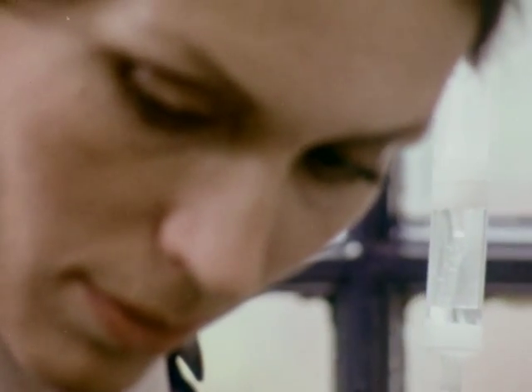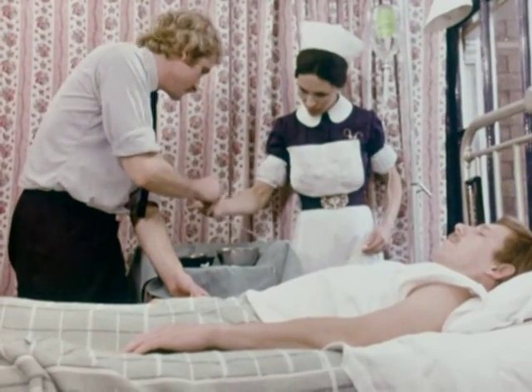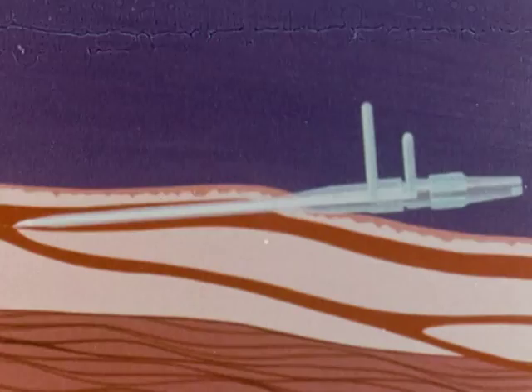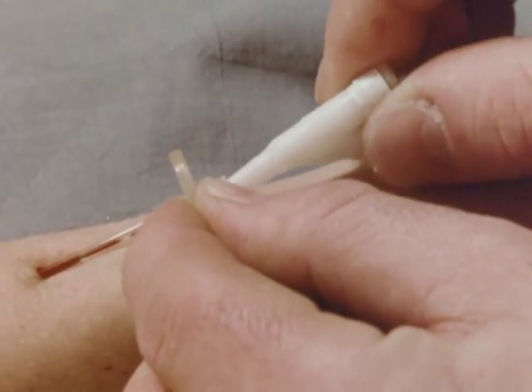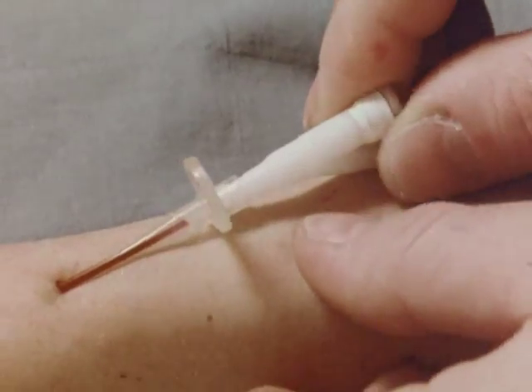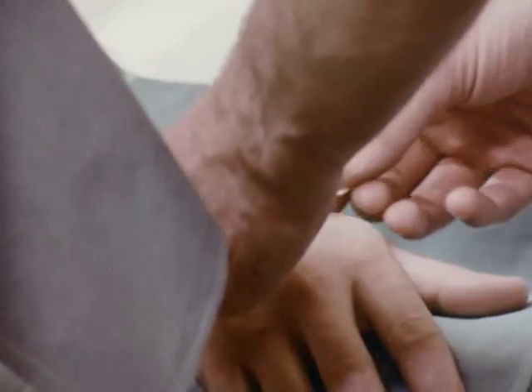At this point, the blood flashes back up the cannula. Now pressure is applied to the skin and the cannula held firmly in the vein while the needle is withdrawn. When the cannula has been successfully placed, it's connected to the luer fitting of the drip set and strapped to the skin, using a length of 1/2-inch tape folded around the base of the cannula.